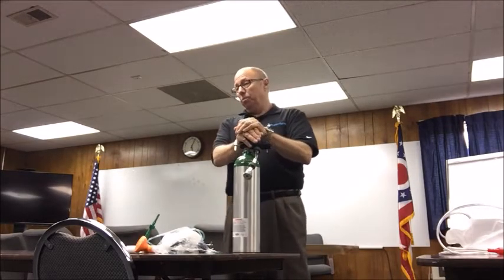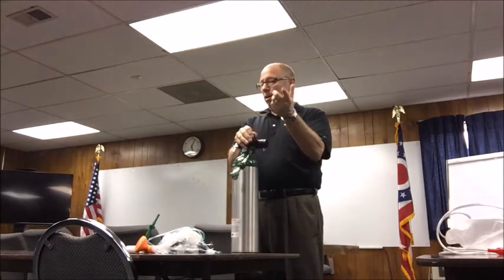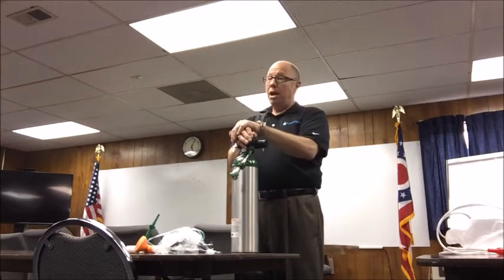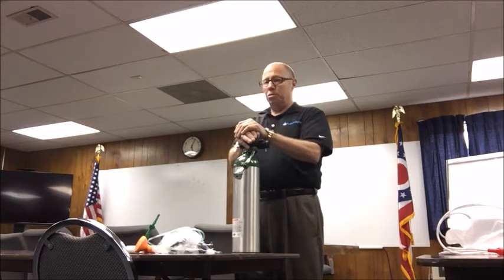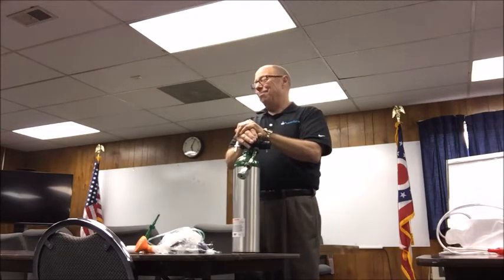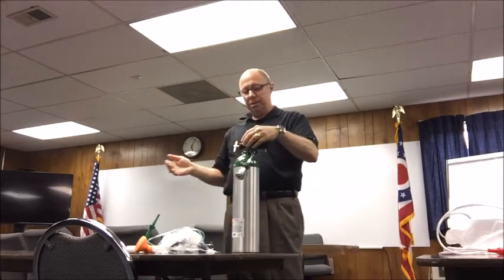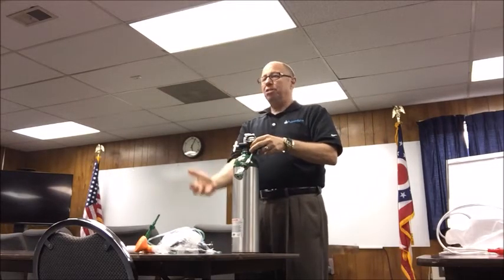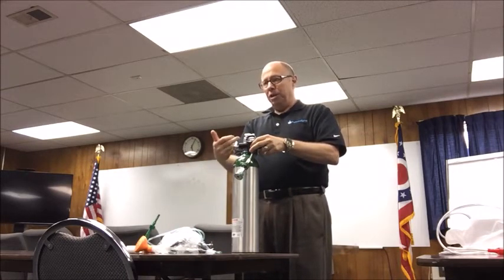Like the Emergent, we use the high pressure side. Does anybody know why we use the high pressure side? Why every ventilator in the hospital, every anesthesia machine, Emergent, all the capital CPAP equipment uses the high pressure side, and we don't use the Christmas tree? The reason why we use the high pressure side is that flow is unrestricted. That is nothing more than a check valve. And when I press that check valve in, I get constant flow out of the tank. I'll drain that tank within 5 minutes if I just hold that check valve in.